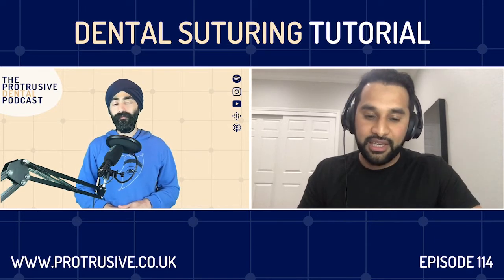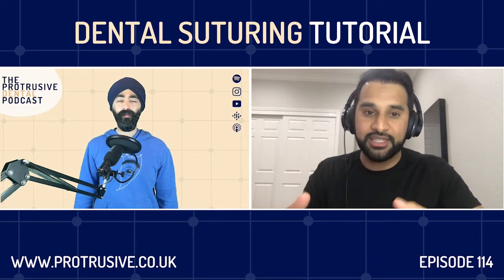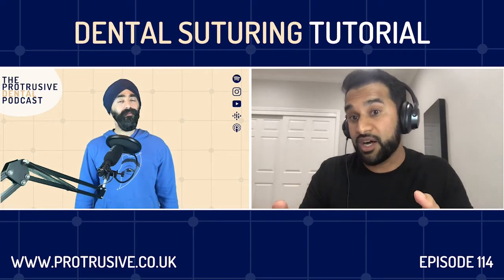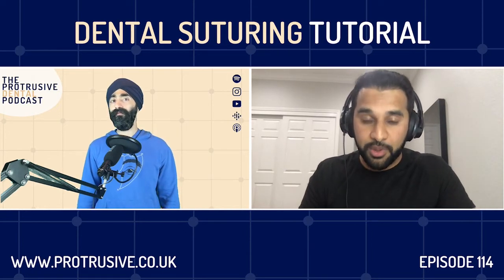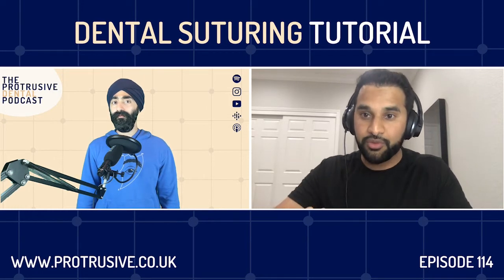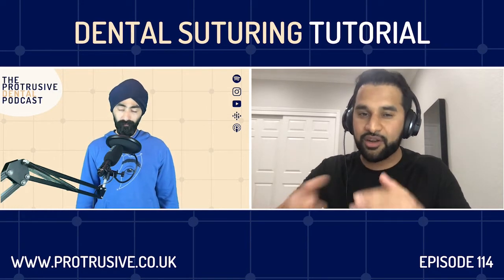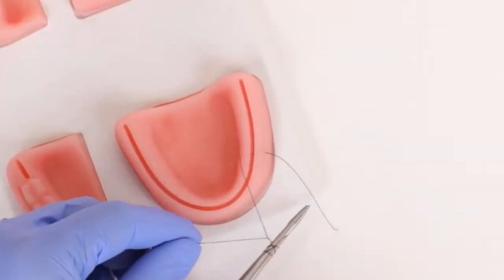What you want to see, and when you throw your knots down, there's various types of surgical knots. The most common surgical knot is 2 forward throws, 1 reverse throw. So 2 times clockwise or counterclockwise, then you reverse it. And then there's what we do, the modified surgeon's knot, which is 3 throws, and it has its advantages and disadvantages.